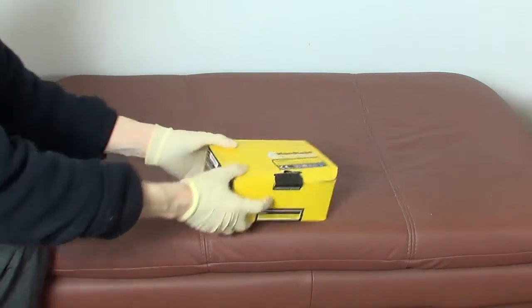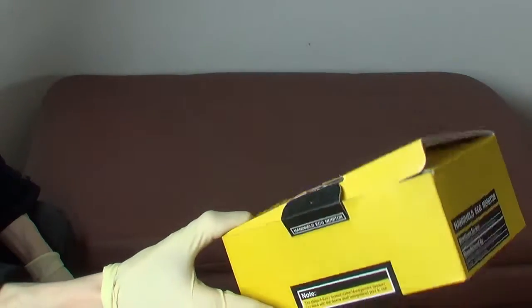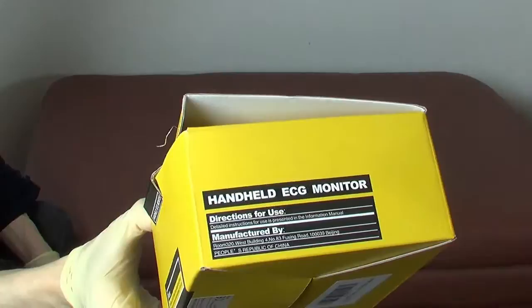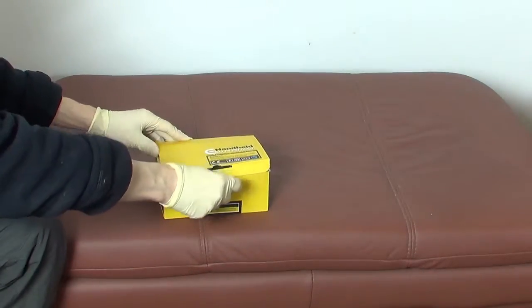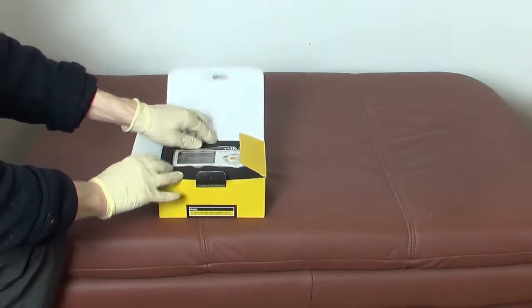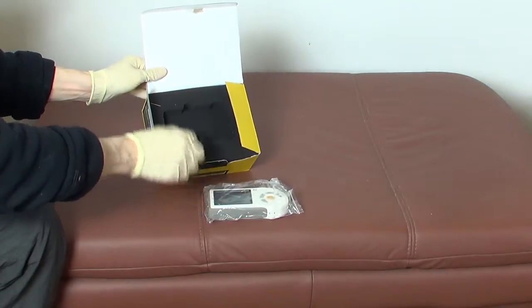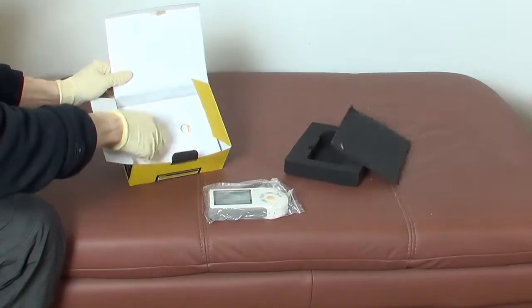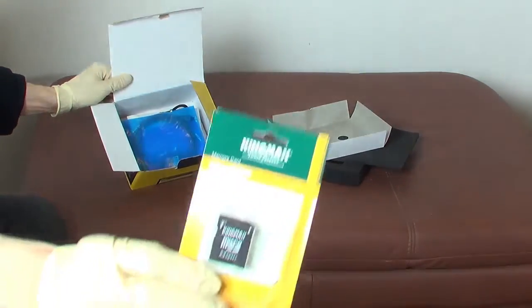This video shows the unpackaging of a handheld ECG monitor bought from Amazon. This device is for ECG waveform self-testing. You can take readings only by using the palm of the hand, or by taking one hand and pressing it against your chest, or you use it with cables and chest electrodes.